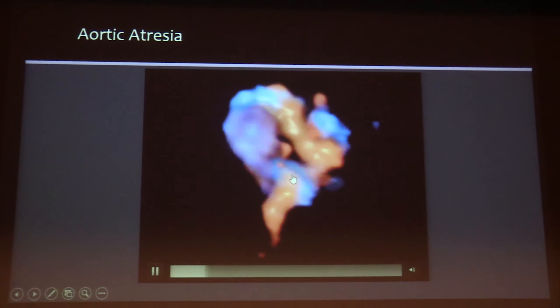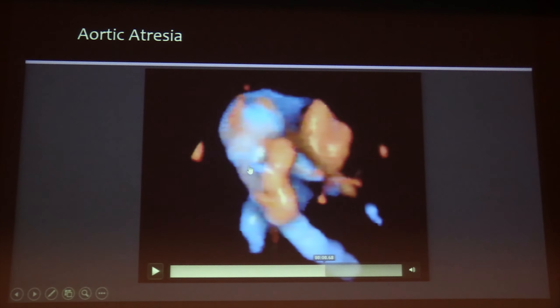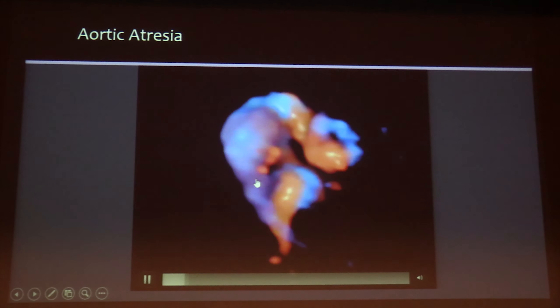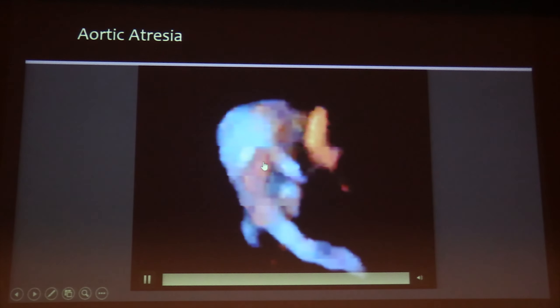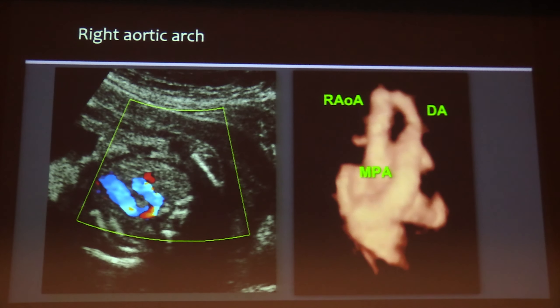You can add a color volume and see the direction of flow. The direction of flow in this narrow aorta is opposite to what we expect at the three-vessel and trachea view. You can see the narrow size of the aorta in comparison to the pulmonary artery. Taking a longitudinal view with the HD volume, you can see the pulmonary artery and the narrow aorta, which explains the situation better.